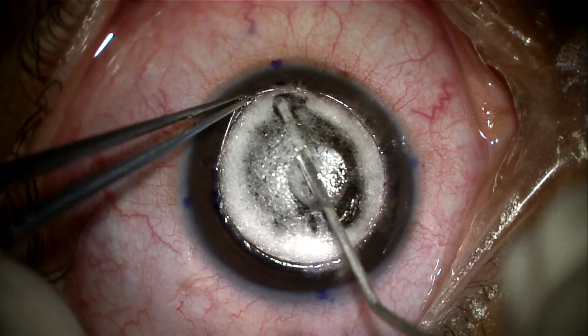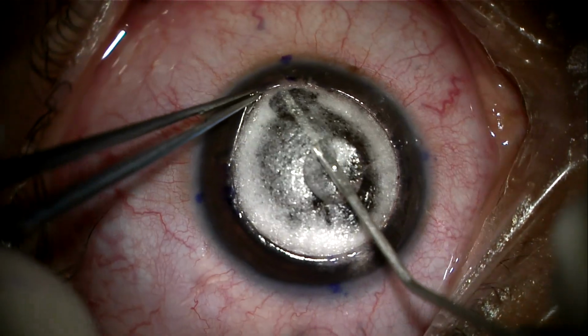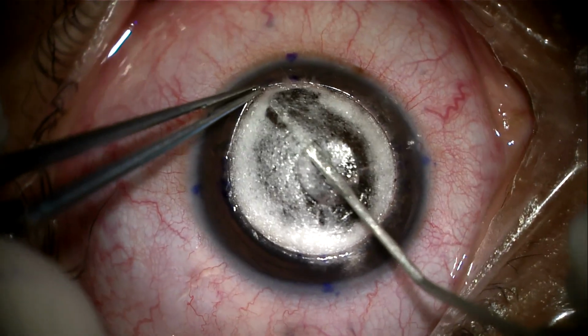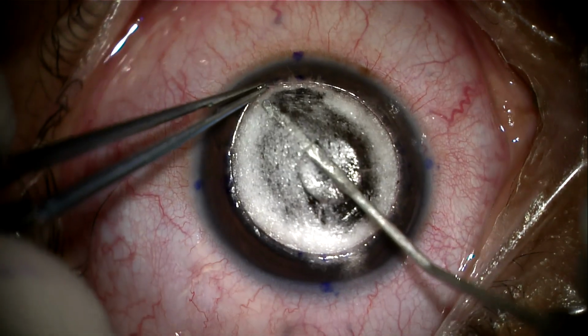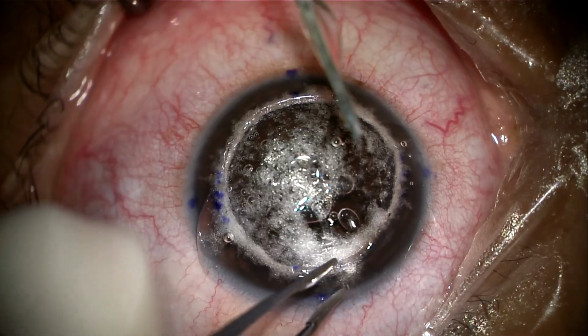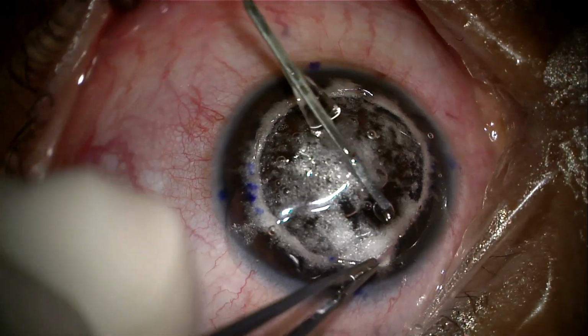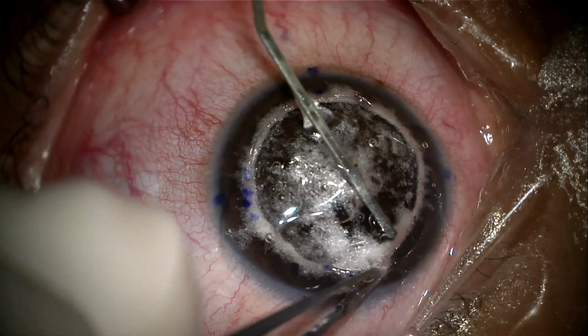Then a superblade is placed on the stroma. The stroma is then perforated rapidly by a fast movement into the full stromal thickness, with fast release of the blade to avoid touching the Descemet membrane with the tip of the blade. The bubble is then re-inflated with cohesive viscoelastic.